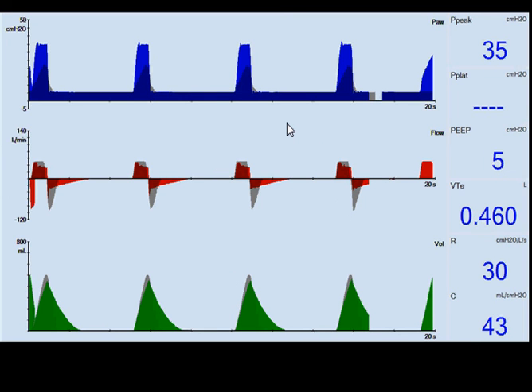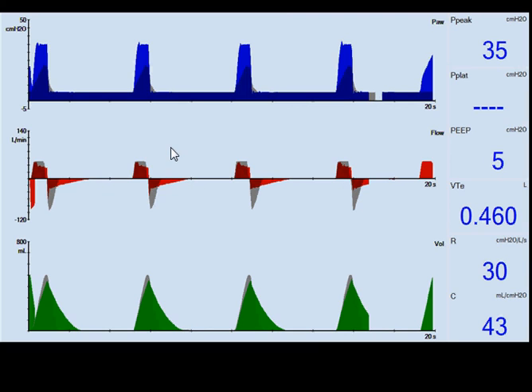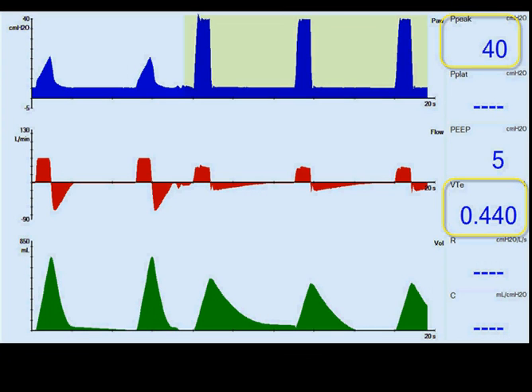The Pmax is set at 35 cmH₂O for protection. Unlike old IPP machines that terminated the breath at a certain pressure, Pmax simply limits the pressure rather than ending the breath prematurely. It limits pressure at 35, which changes the flow waveform slightly and will affect tidal volume. A Pmax of 40 is also demonstrated: the breath starts as volume controlled, flow is consistent until Pmax is reached, then it switches to a pressure-limited breath, affecting tidal volume.